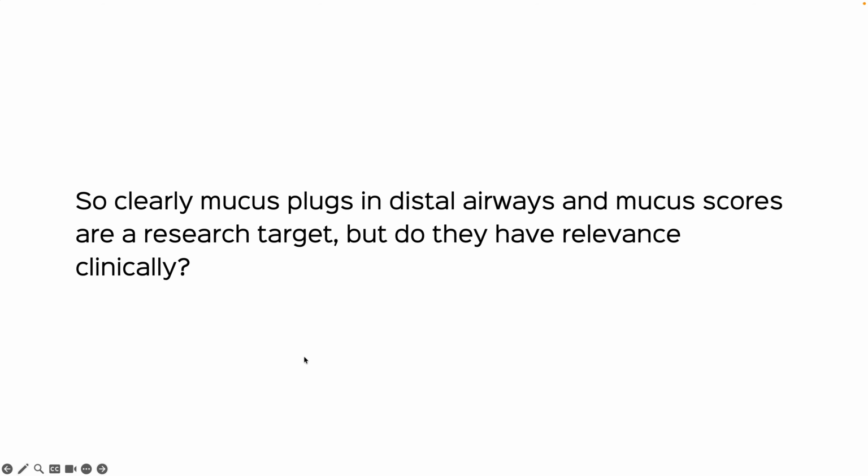That would mean that maybe it's not realistic for physicians to send patients for CT scans just to look for mucus plugs. Therefore, clearly this is all a research thing. So, would they have relevance clinically? As I said, I don't think currently we're going to get patients being sent for this.